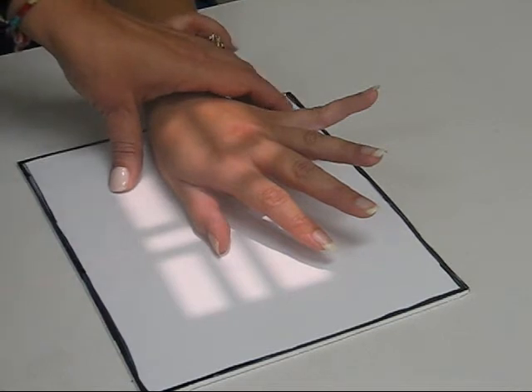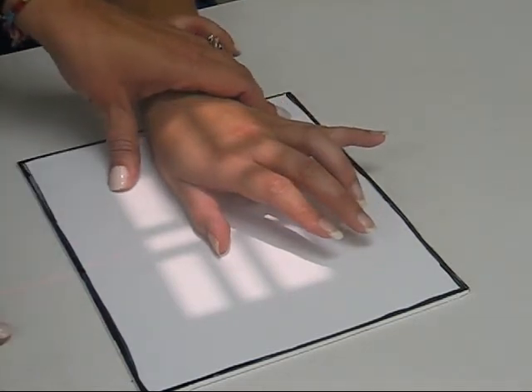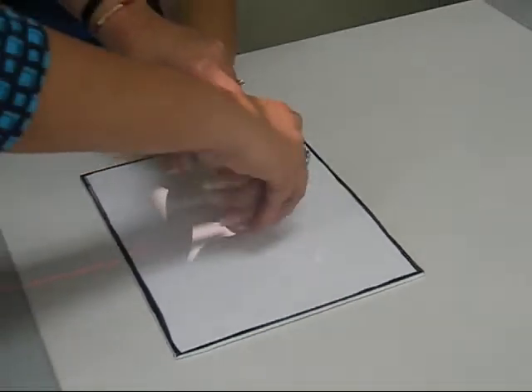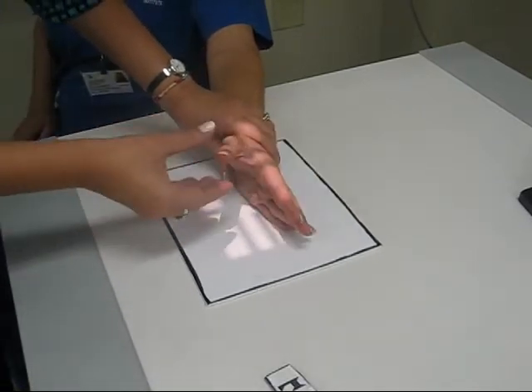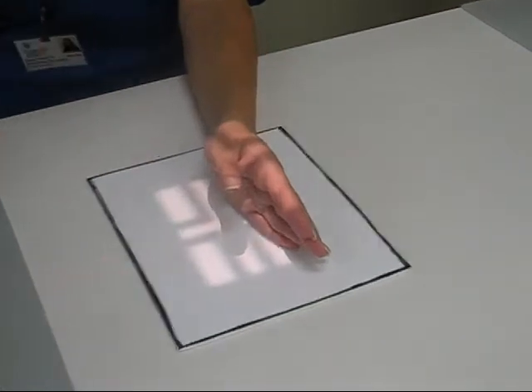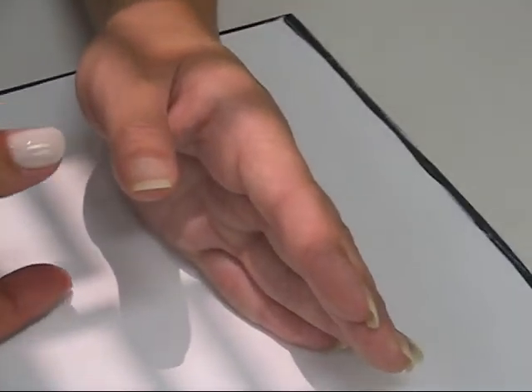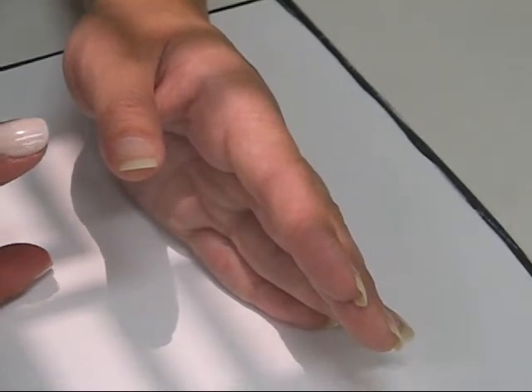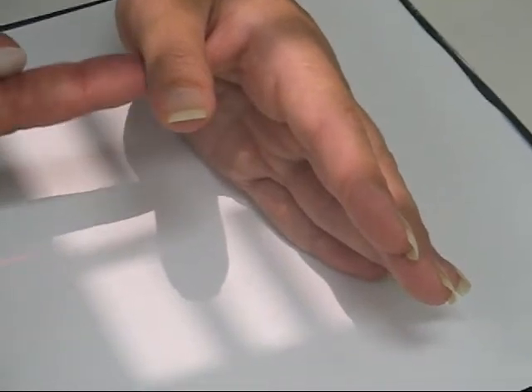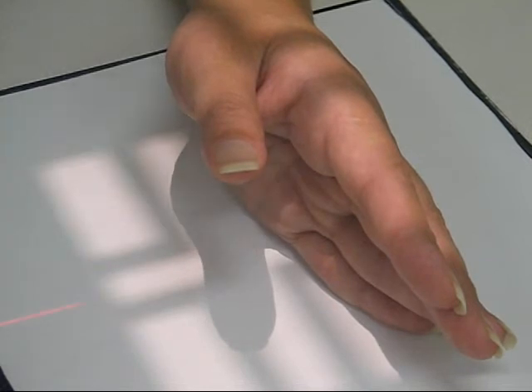Now, so we did the lateral of the thumb and the oblique of the thumb. To do an AP of the thumb, or a PA actually, you can do a PA of the thumb, which you can do this way. Now this projection is going to give you a little bit of distortion, magnification, because you have a distance between the image receptor and the body part.